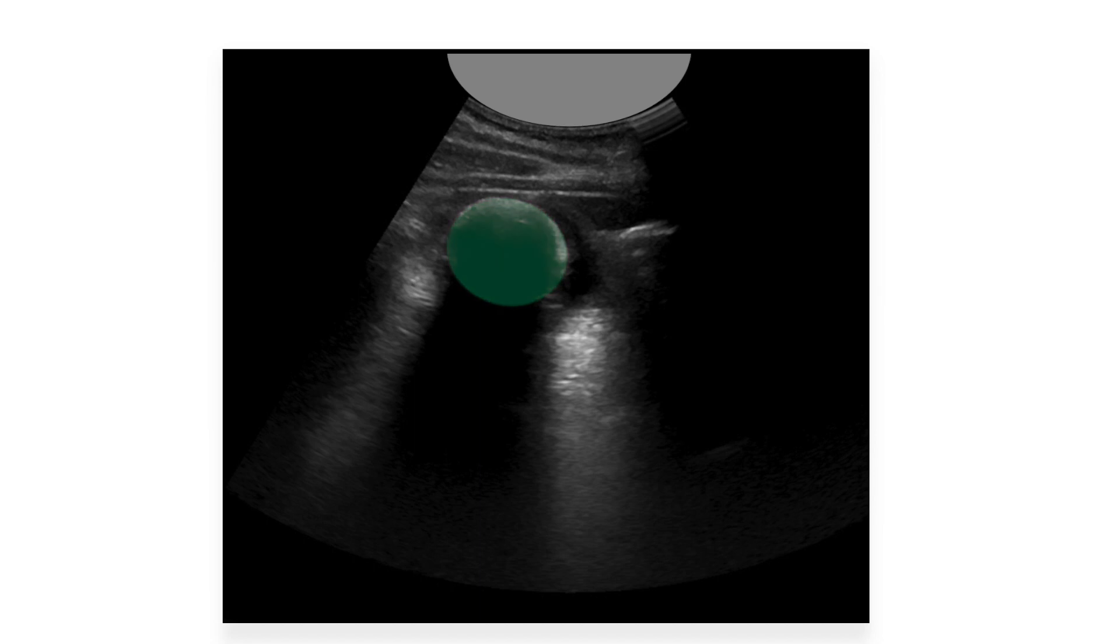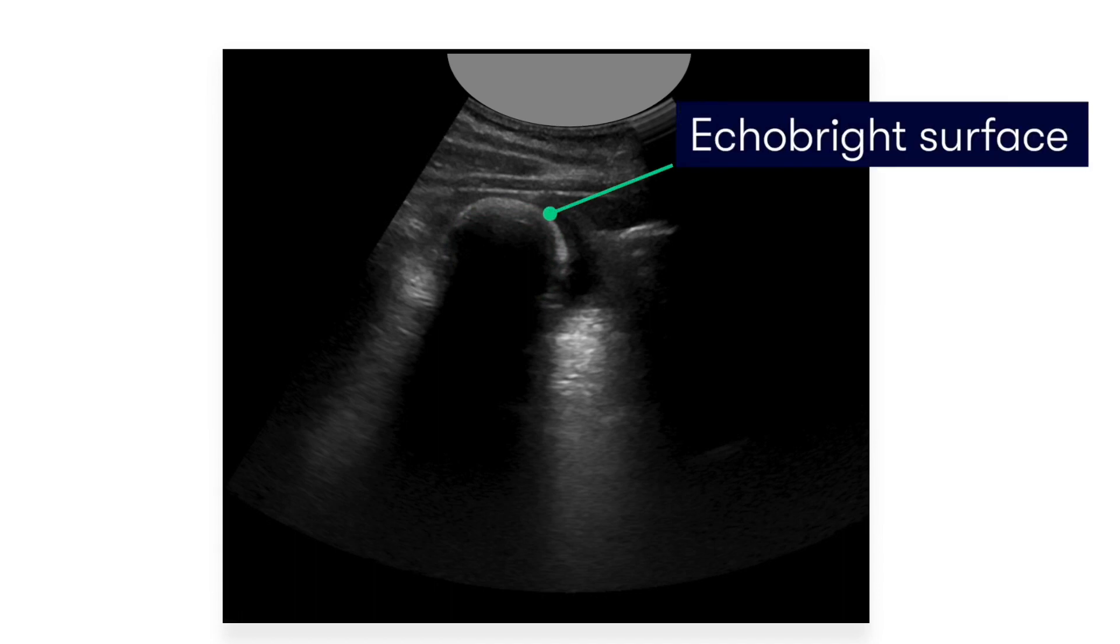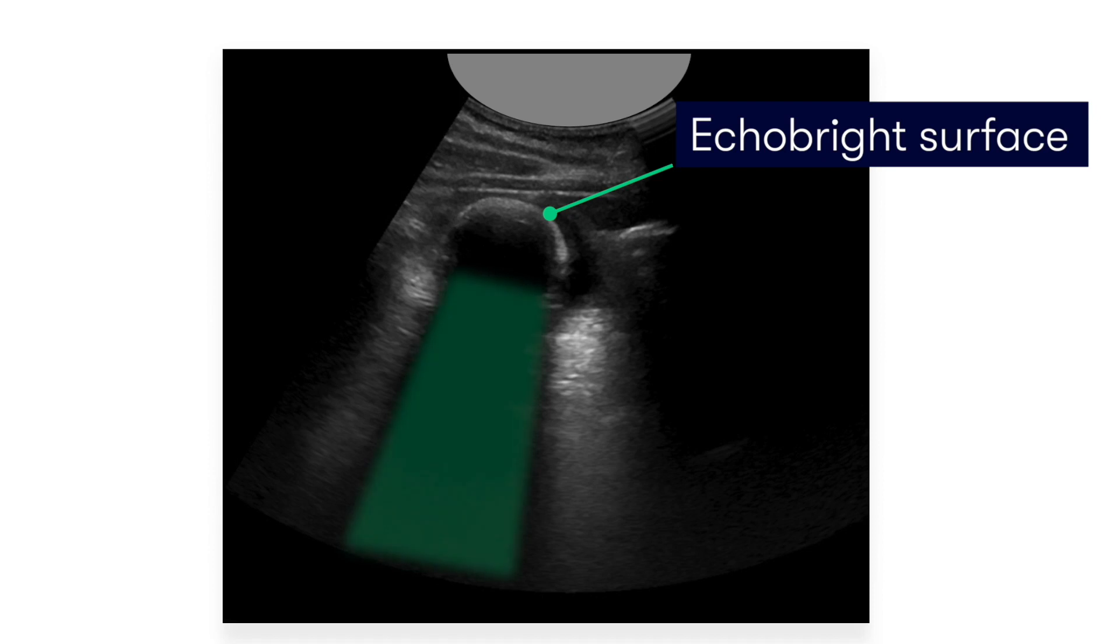How do we know that's a gallstone? Well, as you now know, we are looking for the echo bright gallstone surface, and there it is. And also, we are looking for the acoustic shadow, which should be beyond the stone. And what do you know? There it is.